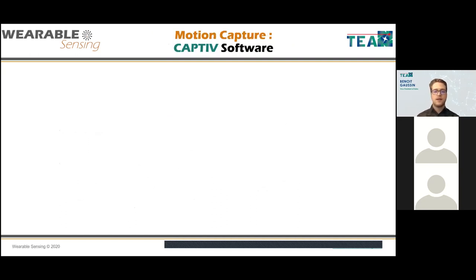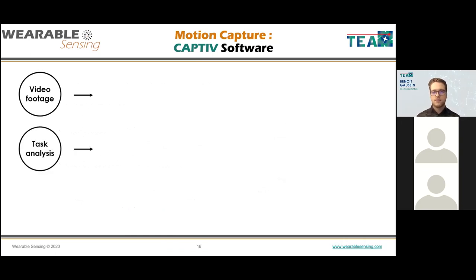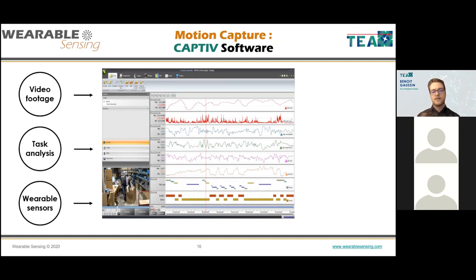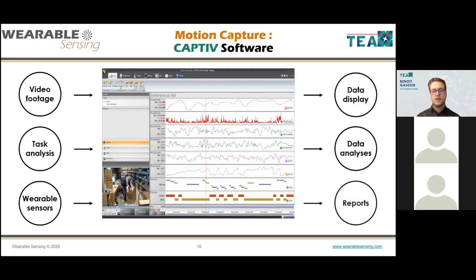For software: Captive takes different inputs — video footage, task information, and data from all wearable sensors (IMU, EEG, eye tracker) — and synchronizes everything in one place. It's not just a display tool; it has powerful embedded analytics and the ability to create reports, export data, and stream to third-party software or virtual environments.